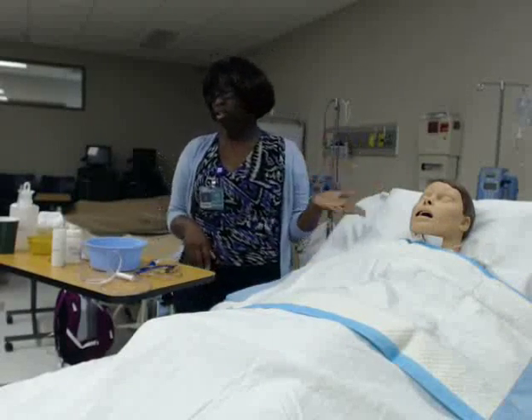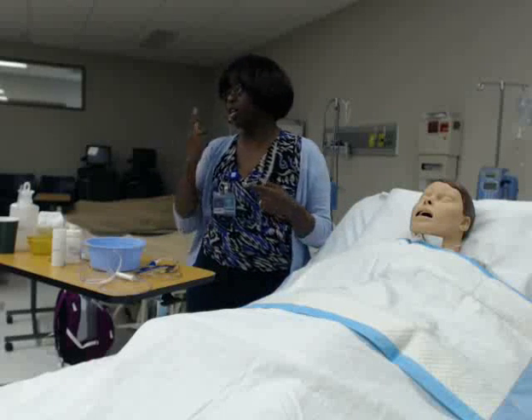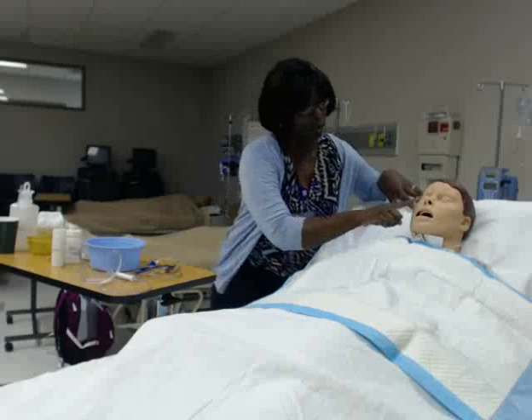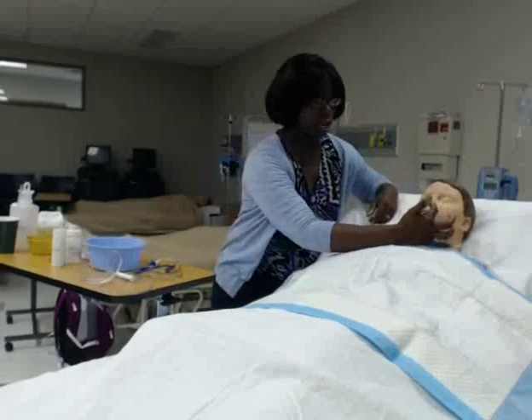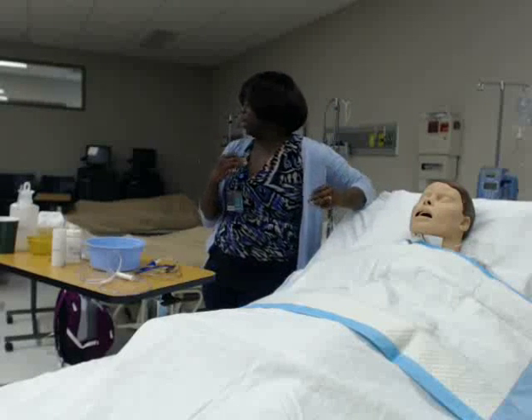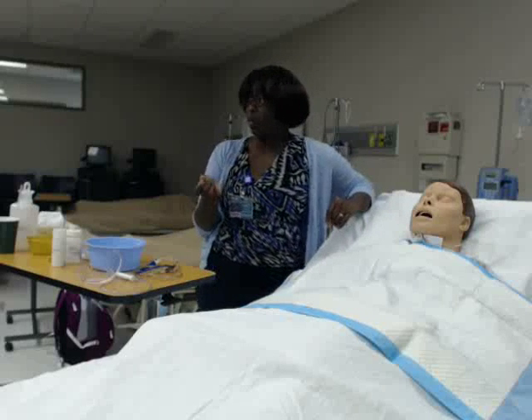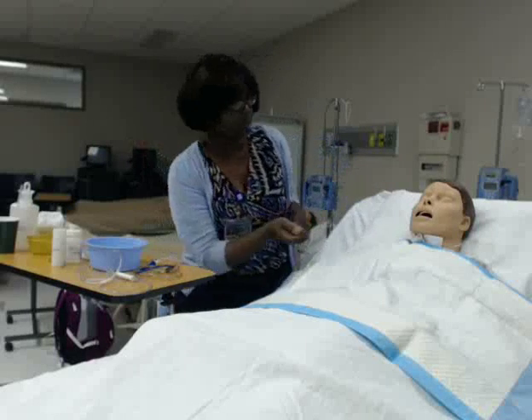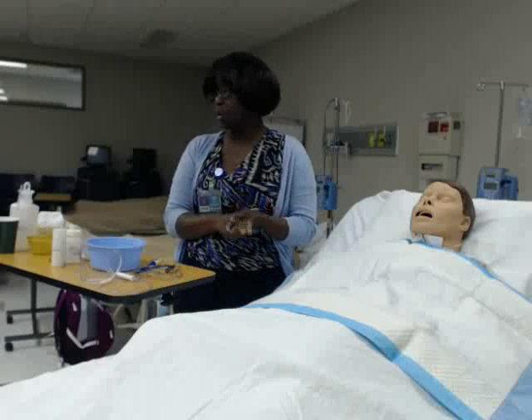I'm going to bring the patient up to at least a semi-Fowler's position and make sure they're comfortable. The first thing I want to do is check the nares for patency — hold one side of the nostril down, have them breathe in through the other, make sure it's patent, then do the same on the other side. We'll go for the most patent side. We also want to take a penlight and inspect inside to make sure there are no sores.